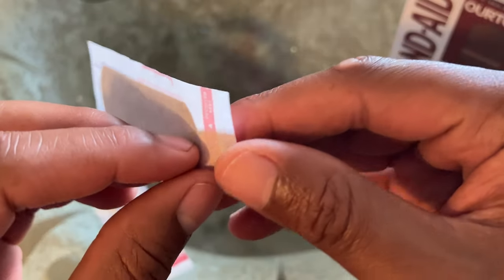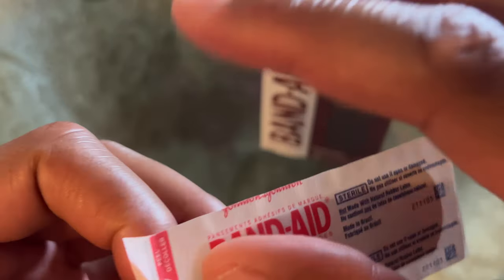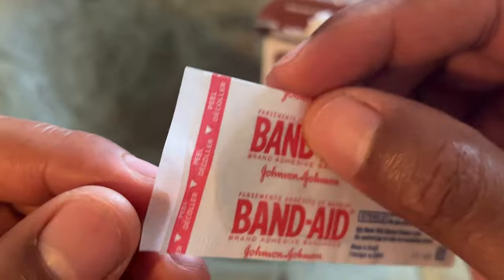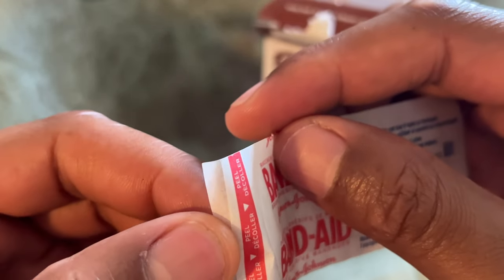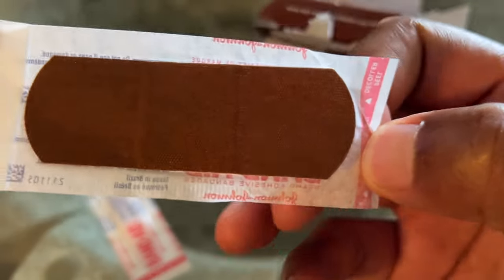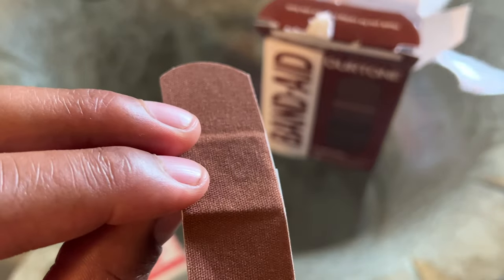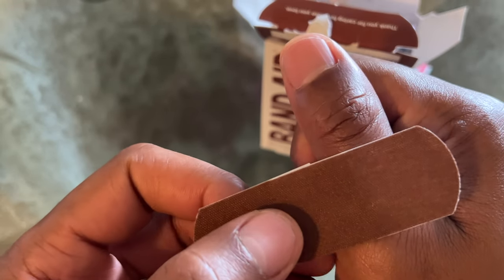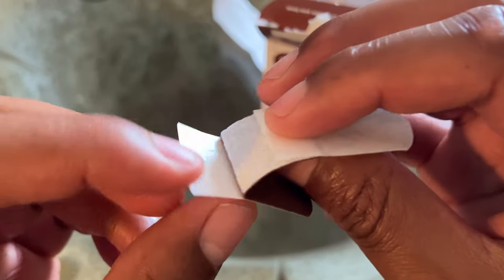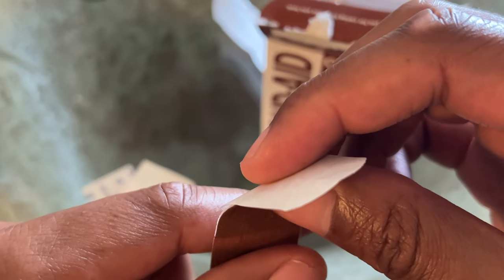I'm going to open this up so you can see what it looks like. These are the Our Tone Band-Aid bandages. On here it says 'pull, peel.' So I open it up and it looks almost like a thin piece of chocolate. See how much it matches my tone? Our Tone kind of matches my tone. I'm going to go ahead and apply this to my finger.